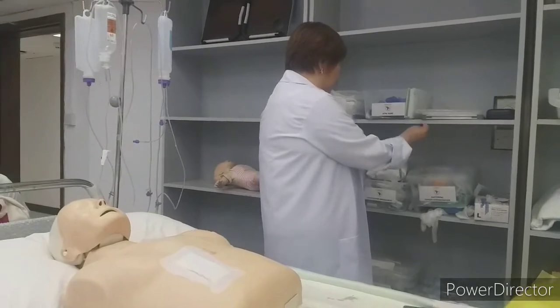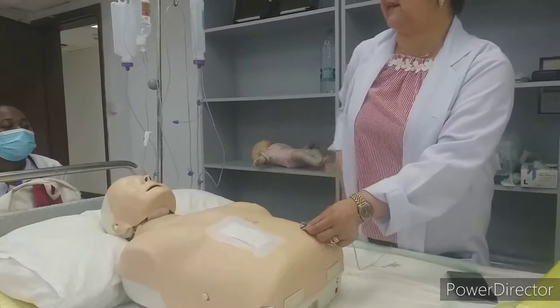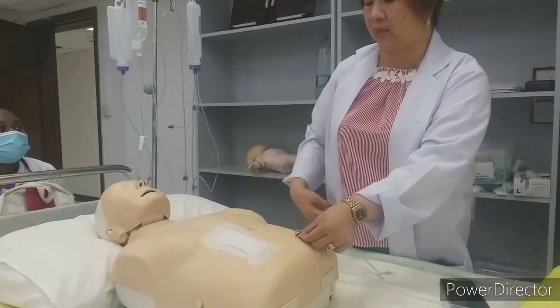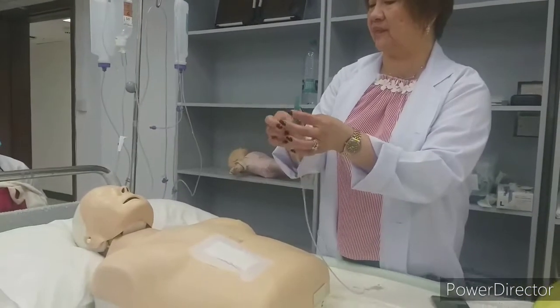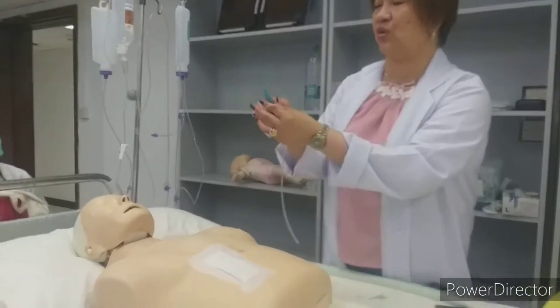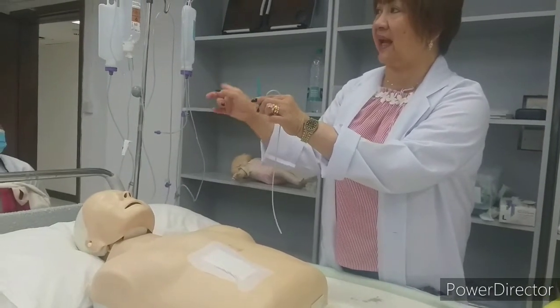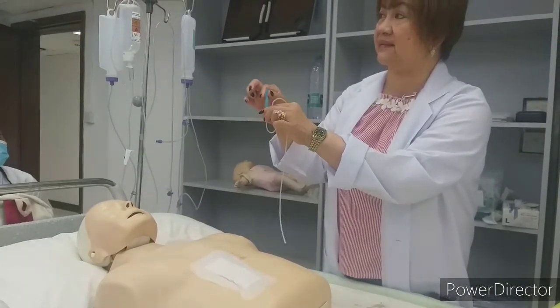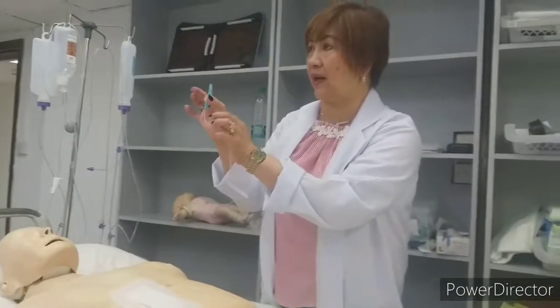This tube is supposed to be here, on this side of the abdomen. This one has two tubes here. One for the feeding, one for the medicine. So there are two ports we are calling.